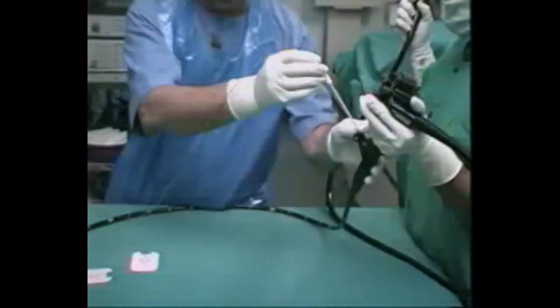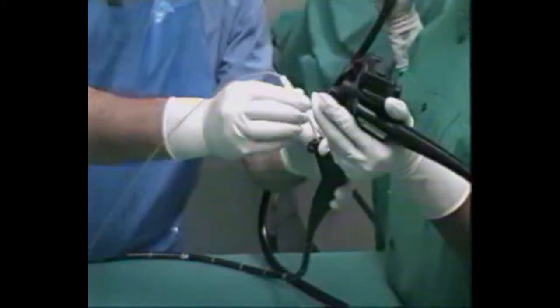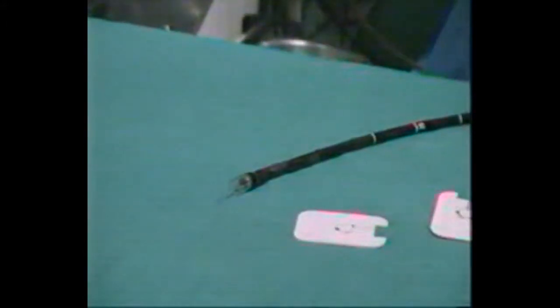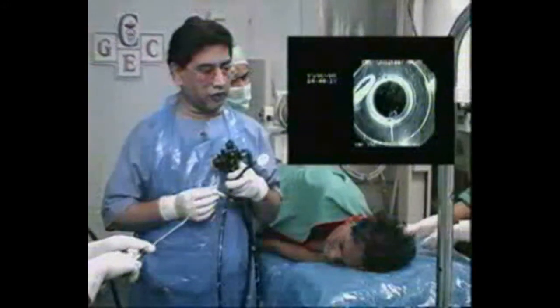The plastic sheet is passed into the working channel of the endoscope, through which the metal cannula is pushed till it comes out of the tip of the endoscope.